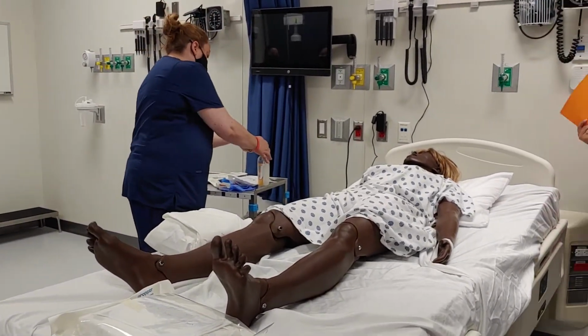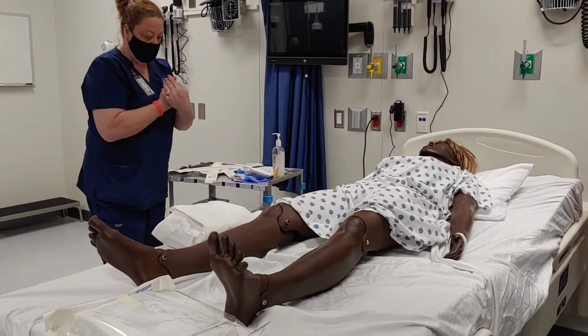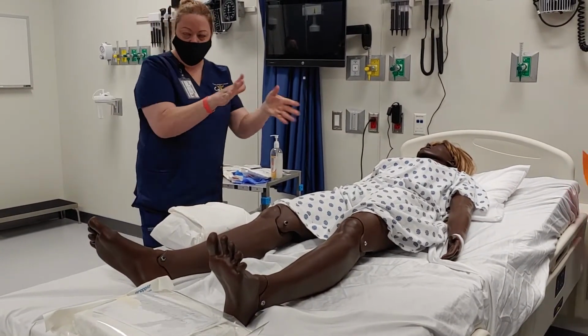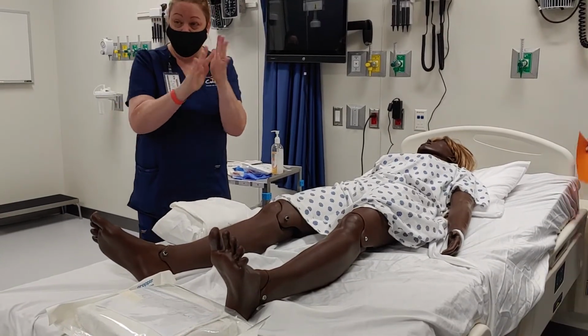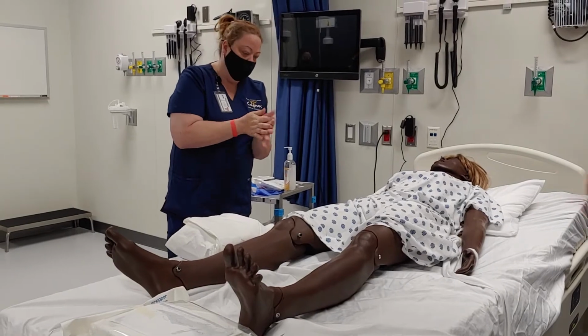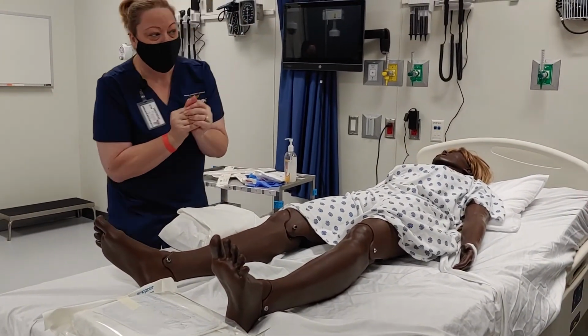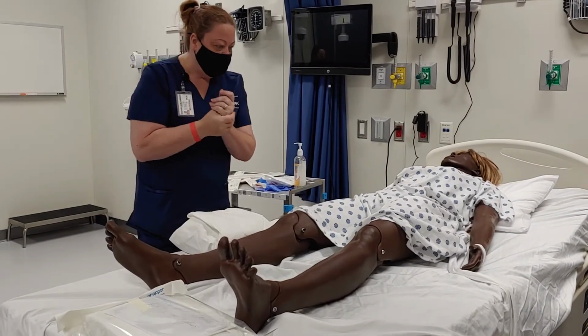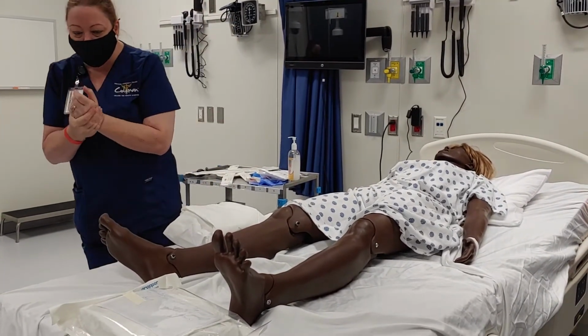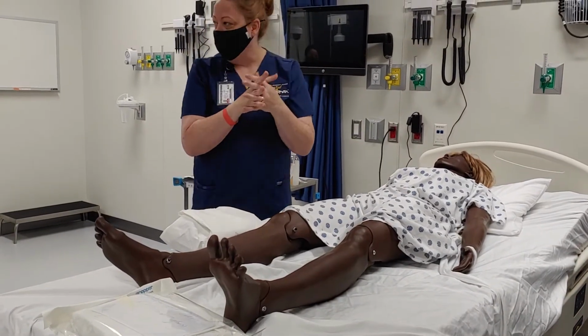I'm going to go ahead and use the hand sanitizer. And again, I've already identified them. I've identified me. They know what's about to happen. Now, it's very important while we're doing this that we maintain as much privacy as we can. And this person doesn't even have a sheet, so that's going to be really difficult. But we shall do our best. You don't see a sheet laying around, do you?